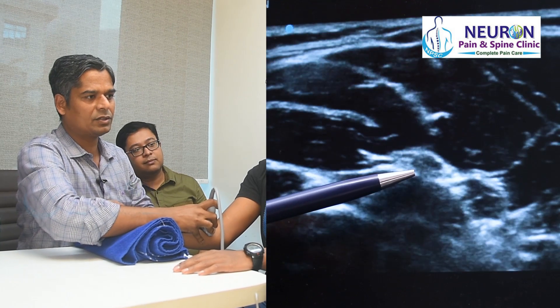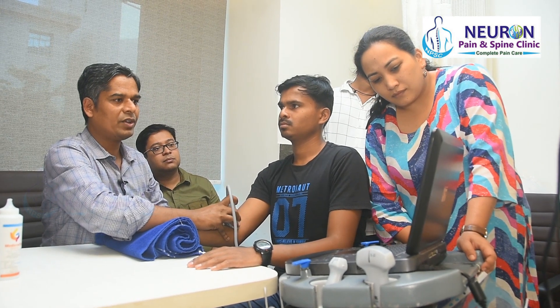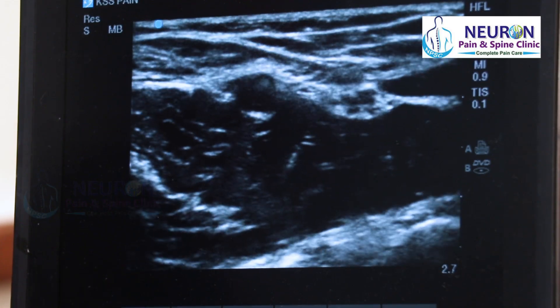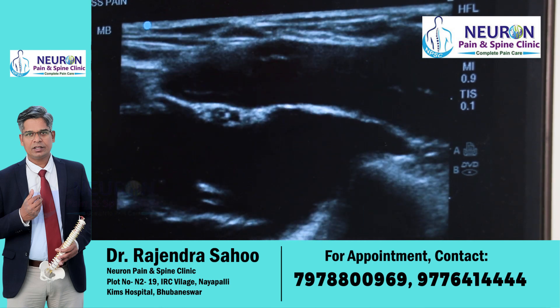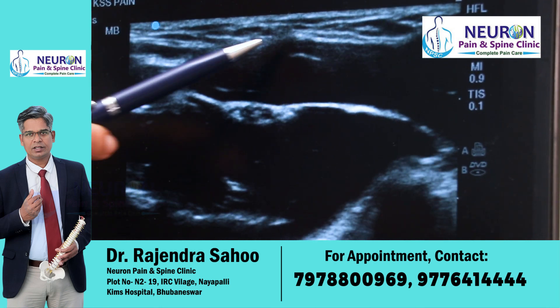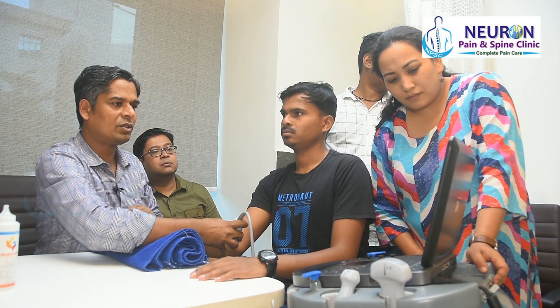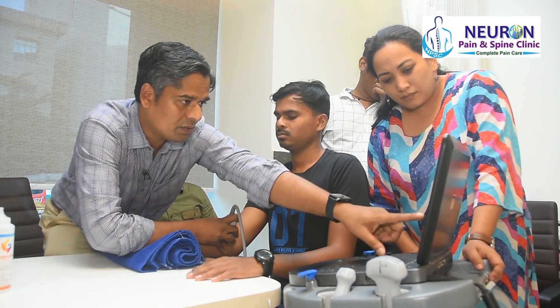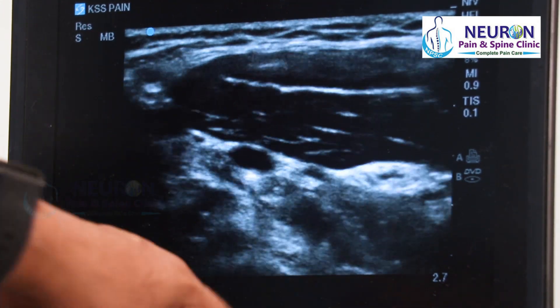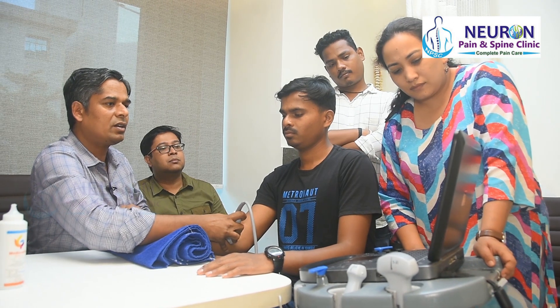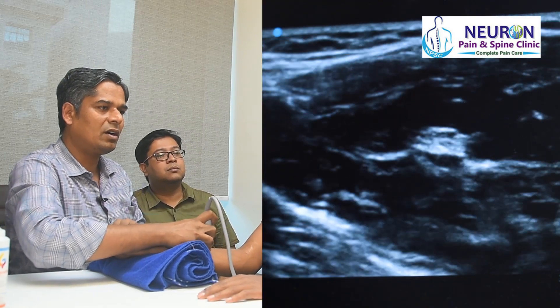Median nerve — slowly going up. I'm about to reach the elbow. Here is the elbow, this is the brachial artery pulsating, and that is the median nerve on the medial side. That is your pronator teres muscle. The nerve slowly goes between the two heads of pronator teres — superficial and deep heads. This artery will divide into two branches — the ulnar artery — into two branches.